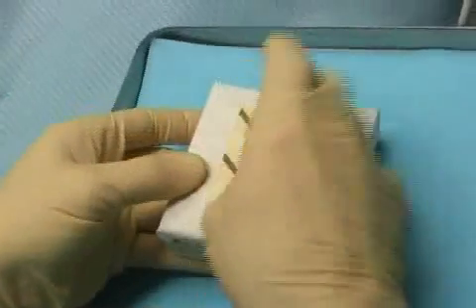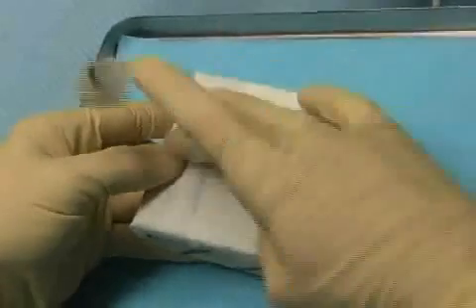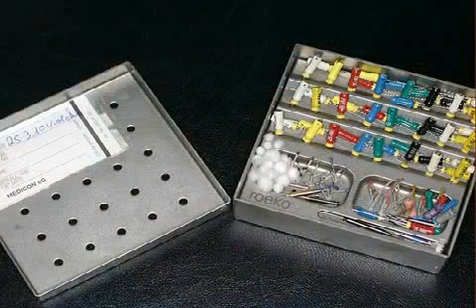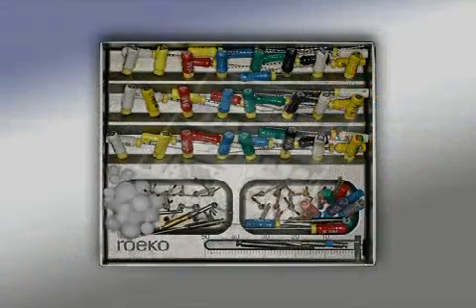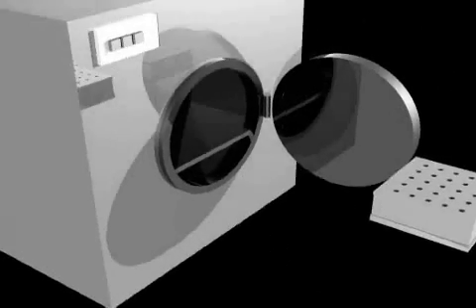However, the rubber dam is not very helpful if non-sterile instruments are used. In the film, you see a Roeko Root Treatment Box that has been sterilized and is unpacked immediately before treatment. The various instruments are neatly sorted. The sterilization of the metallic box and its contents guarantees that there are no bacteria on the instruments that could potentially be imported into the root canal.